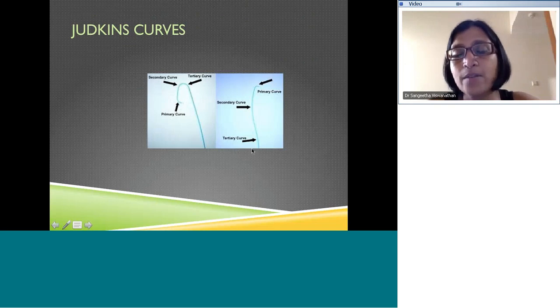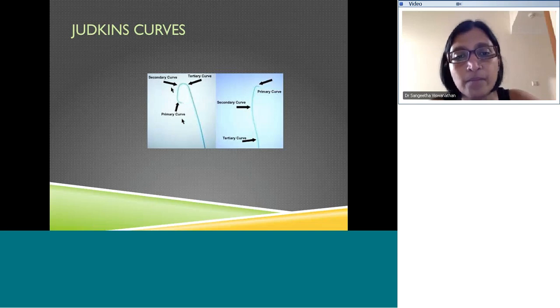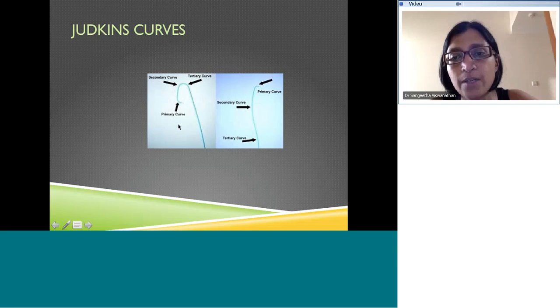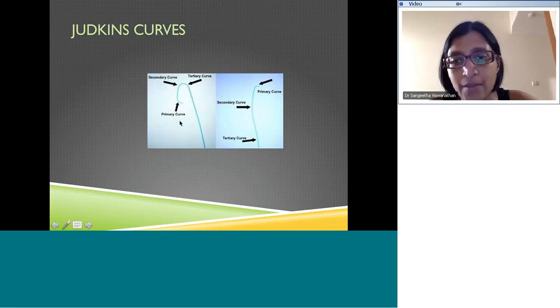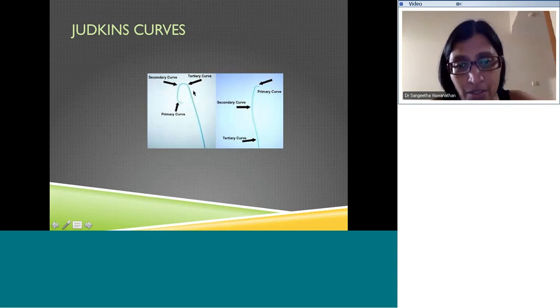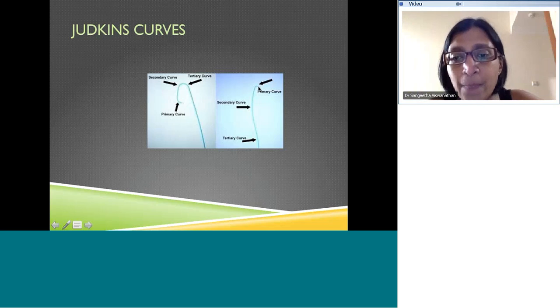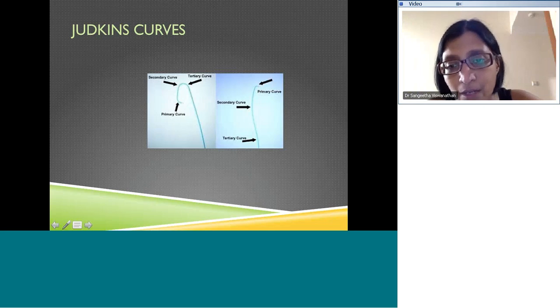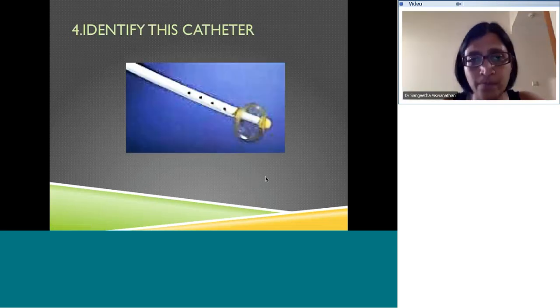Looking at Judkins catheters — these are coronary catheters. The Judkins left has a primary curve closer to the tip, with secondary and tertiary curves behind it. In the Judkins right catheter, there is a very short primary curve just at the tip, then the secondary and tertiary curves. This is how you identify the curve of the catheter.